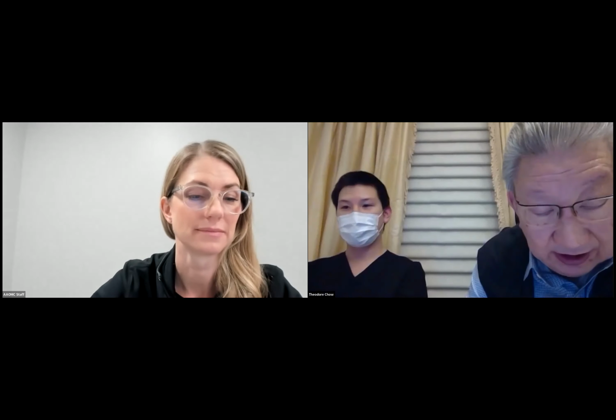How much does the lens movement on the eye influence your decision to change the fitting parameters, for example, to loosen or to tighten? I think they're talking about sodium fluorescein pattern movement on the eye with the slit lamp. So small movement, it will be. You have to understand, you cannot tell the tear film, but the natural eye tear film is composed of 3 microns already. So even though it's totally dark, there's still 3 microns under the alignment curve area.